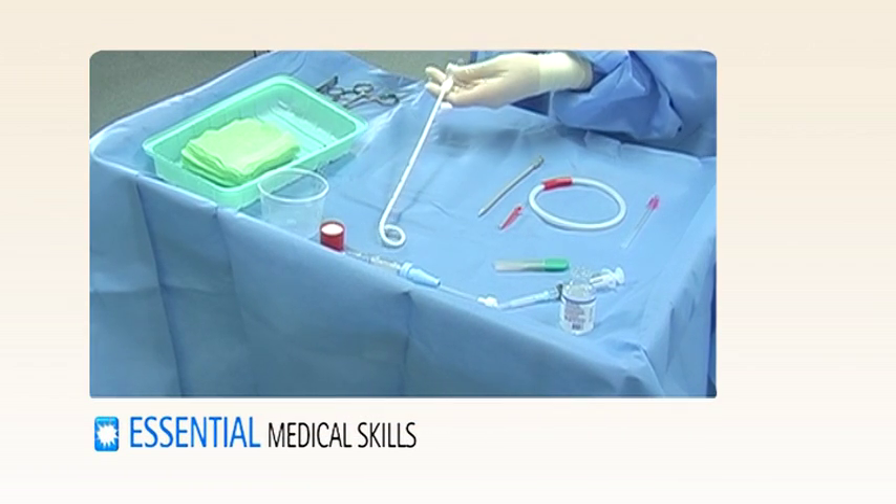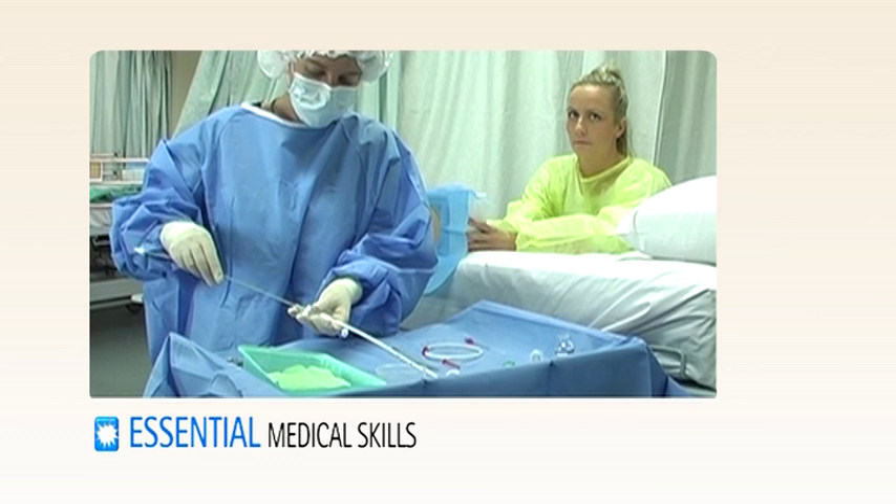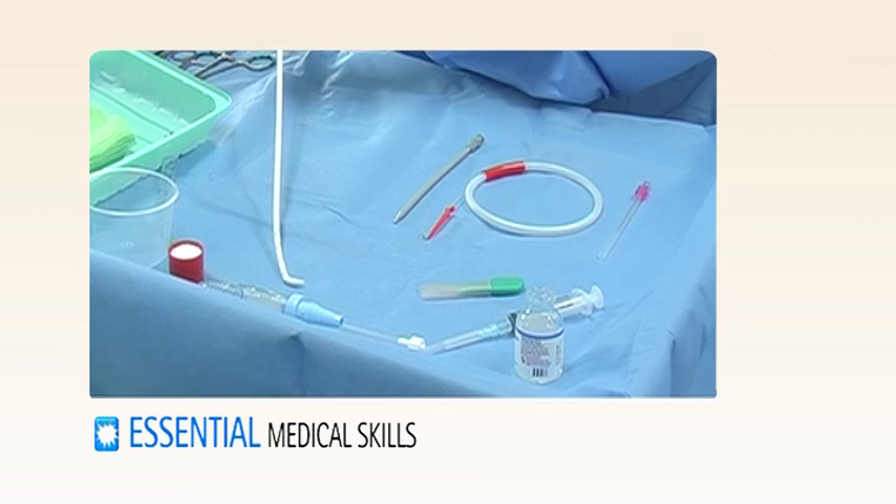With the pigtail catheter kit, it's important to straighten the pigtail with the internal introducer before starting the procedure.